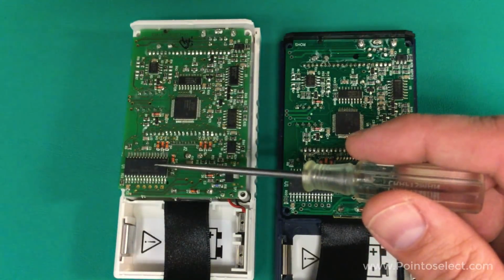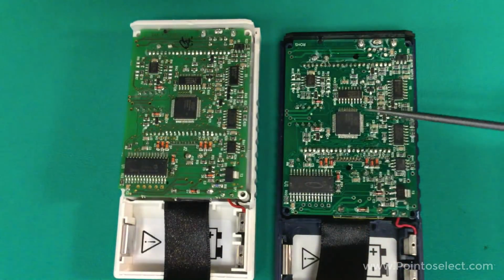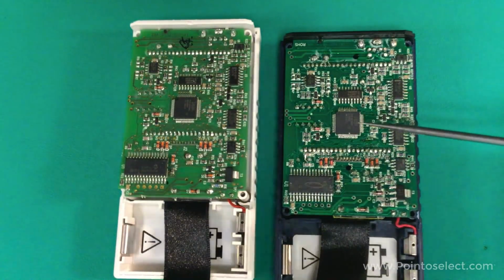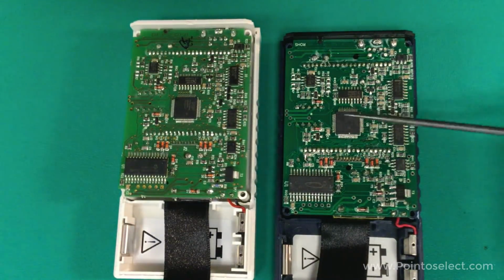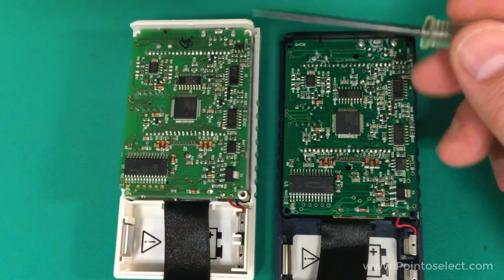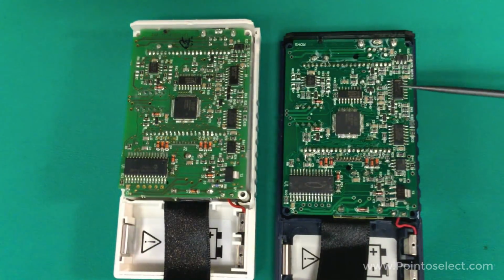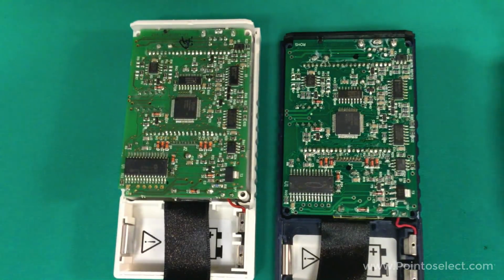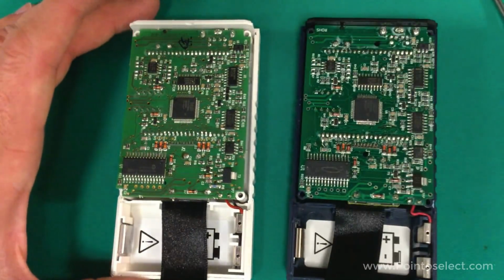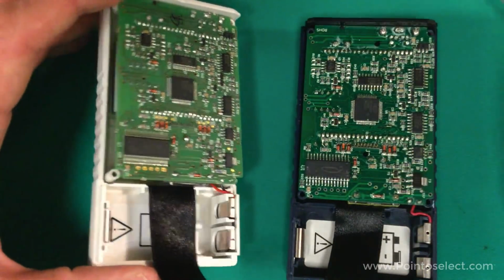Looks like we've got a microcontroller here. That would be the brains of the unit. We've got another large chip. That's probably going to be the LCD display controller, and a few other microchips, integrated circuits in the same places. Board layout looks to be exactly the same in every respect. Let's take a look and see what we've got here.